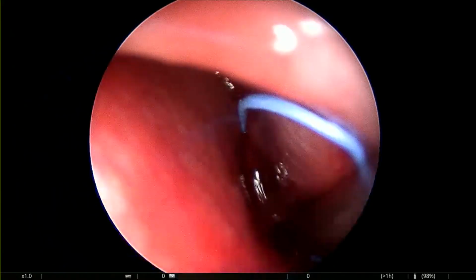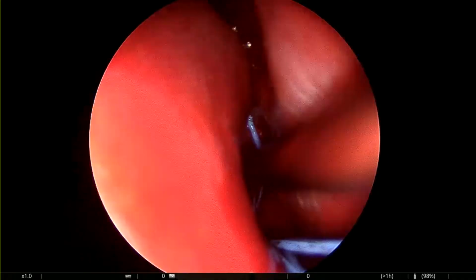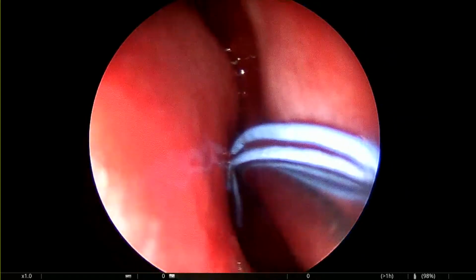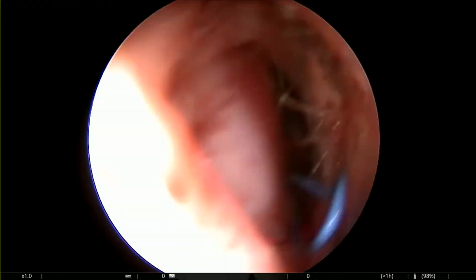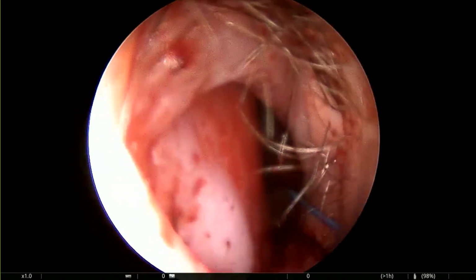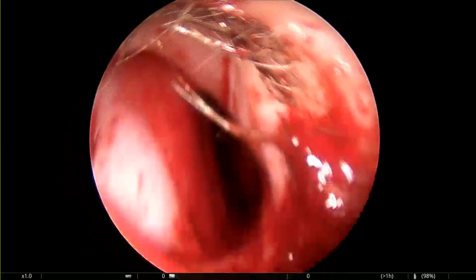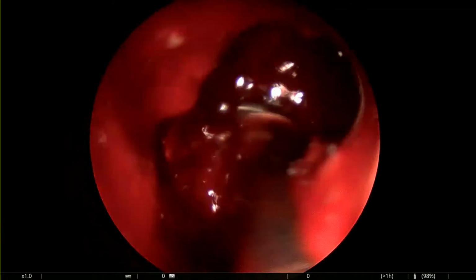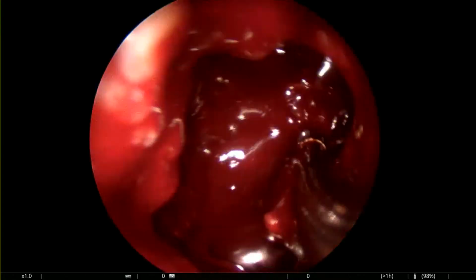Okay. So the anesthesiologist also controls the blood pressure. So now it's good. Yes. Okay. So I remove my pledget cotton. Like that. Okay. Bravo. So, in the maxillary sinus, there remains a little in the lateral part.